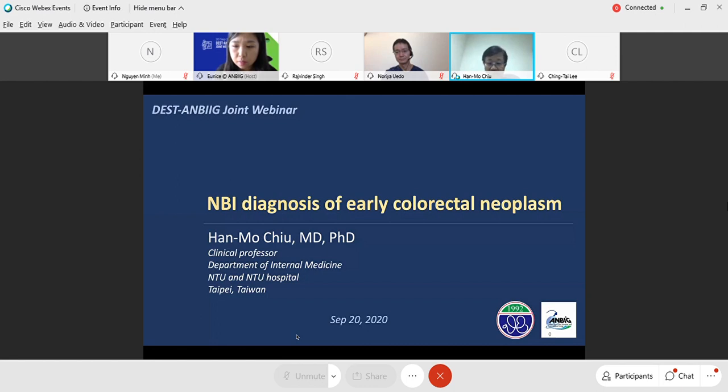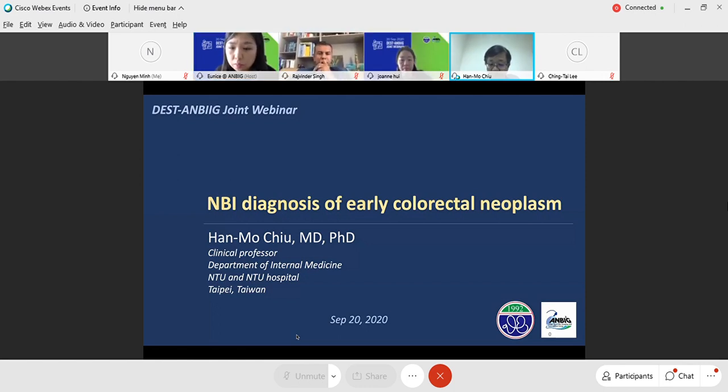So next, I would like to talk about the NBI diagnosis of early colorectal neoplasm. And as mentioned by Noria, it is also very important to describe the basics of diagnosing colorectal neoplasm, including chromoendoscopy. So I will also include some of the basic concepts in my talk today.